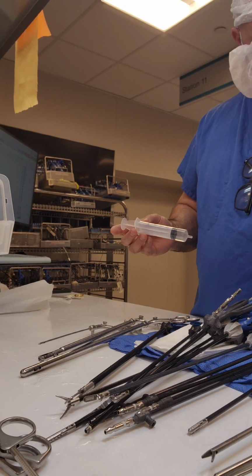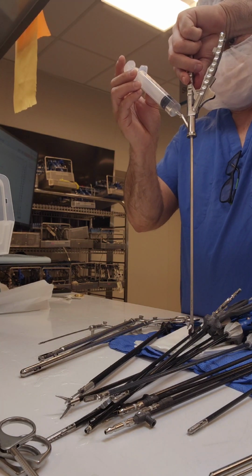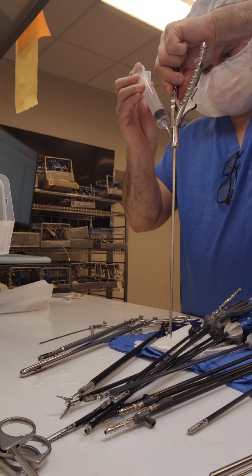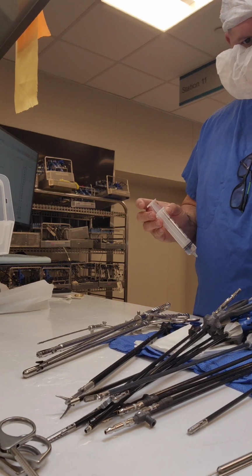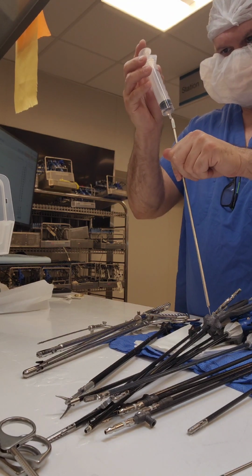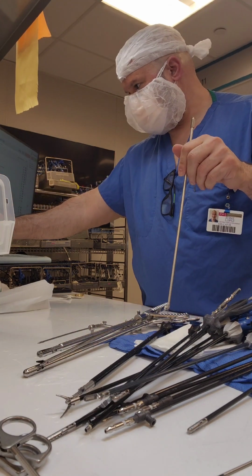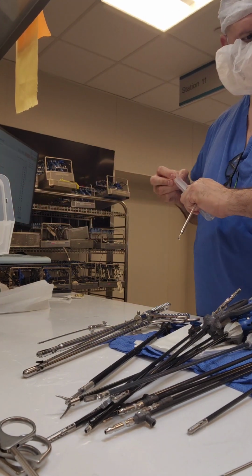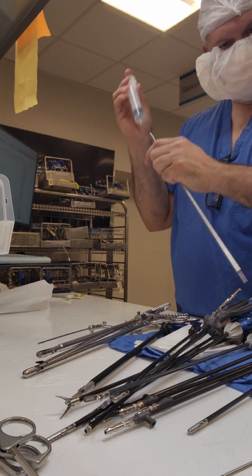Again, you want to make sure that your instruments are clean. This is the only way that you're going to verify cleanliness, unless you say, you know something, I don't need to verify cleanliness on the prep and pack side because my decon crew does it all. So if that's the case, why do we inspect instruments? We're inspecting to make sure that the cleaning was done correctly, that the cleaning process was successful.